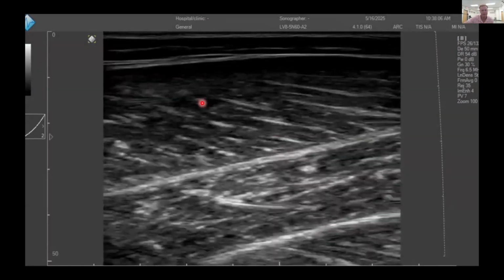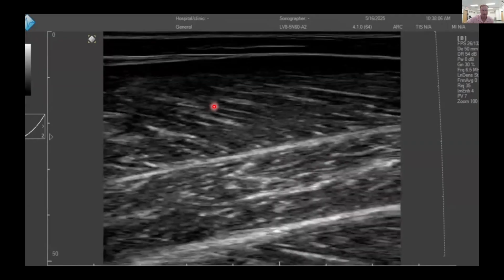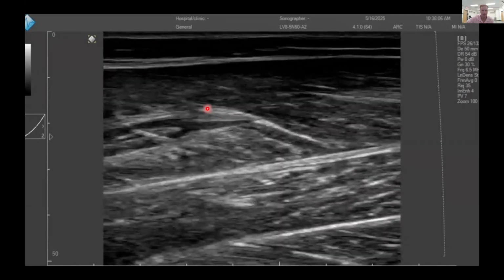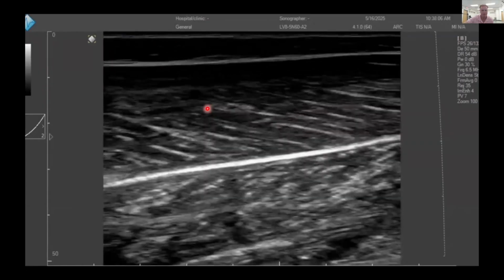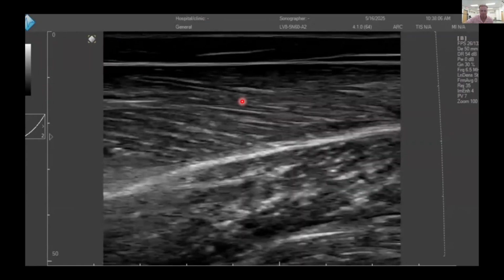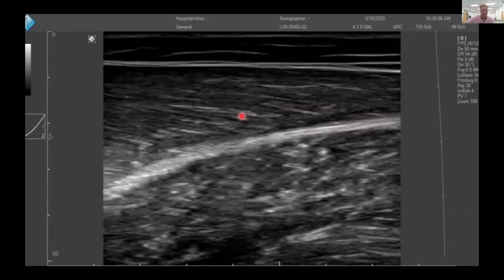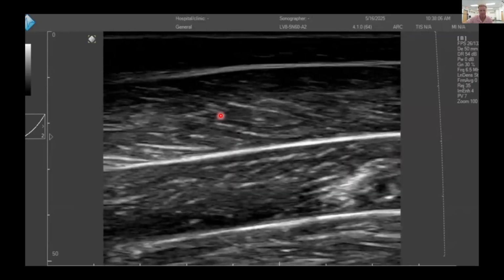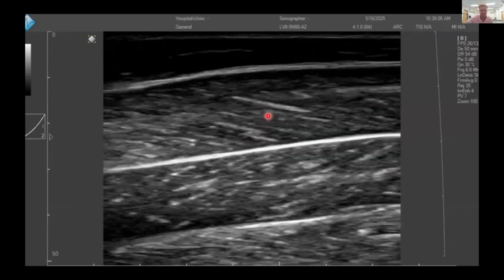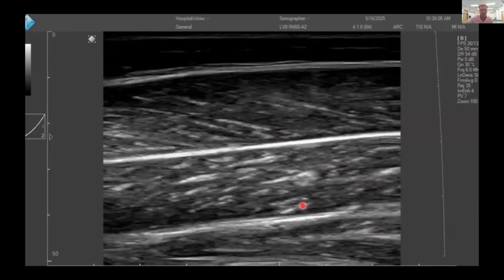So I'll start again. Medial gastrocnemius, really the medial part, going around my calf towards my lateral gastrocnemius. Here's the aponeurosis coming in that will disperse between my medial and lateral gastrocnemius. Now lateral gastrocnemius with a good shot of soleus below.